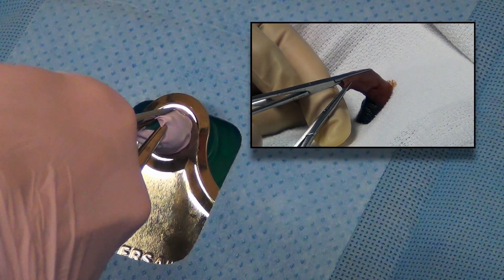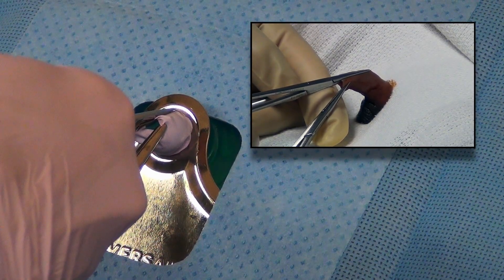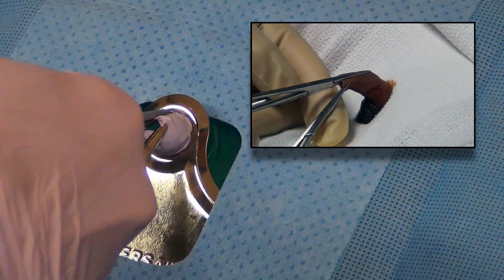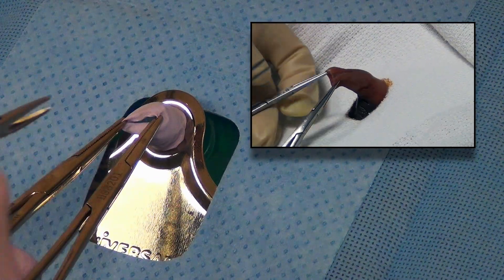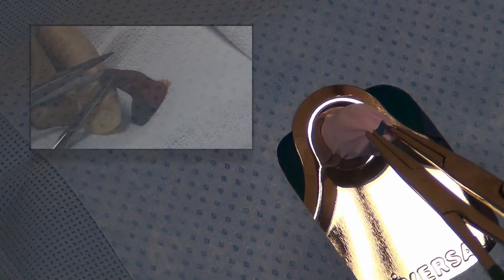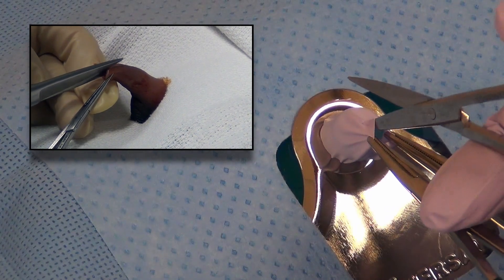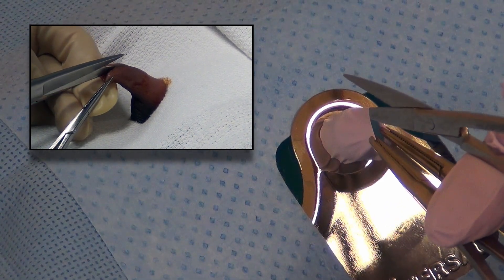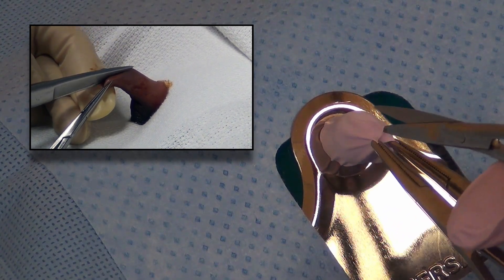A dorsal slit must almost always be created in order to place the bell of the Gomco clamp. This is done first by crushing the foreskin to be removed with the hemostat just above the corona. The crushed foreskin is then cut open with scissors. Crushing the foreskin allows for hemostasis.